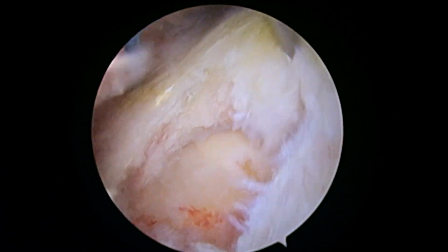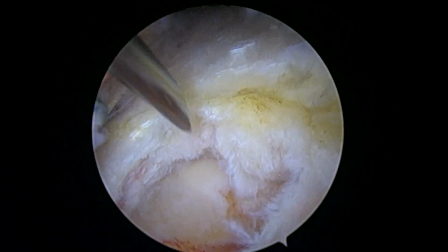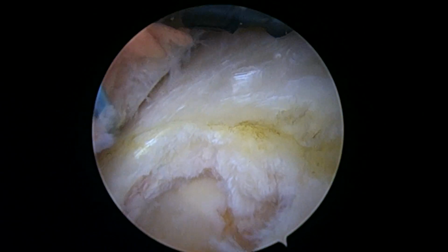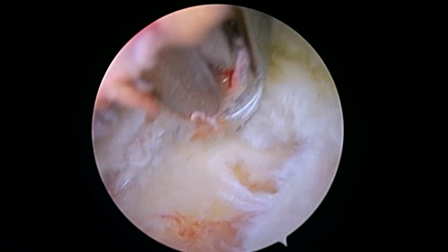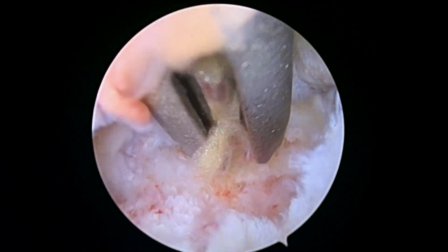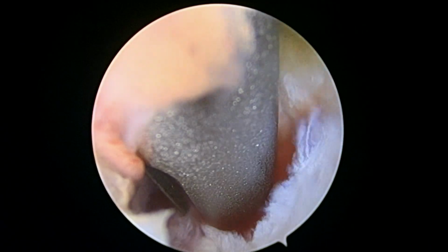Okay, so here's the tear, this little hole right here. We're going to place an anchor in the bone right about here. Go ahead and pull it. You'll see a guide come down in just a minute. It's just a metal tube, and that's what allows us to place the anchor in position. So here's the tube. That's the tear right there. And we're going to place our anchor right about here. So let's go ahead and pull that, put it in.